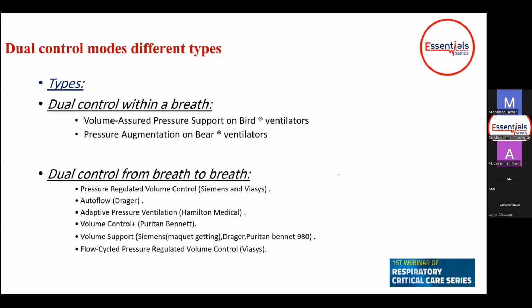You do have sometimes in Bennett ventilator, volume control, VCV, and VCV plus. So VCV plus is a dual control mode, not a volume control mode. A spontaneous mode, which is dual control, common spontaneous mode, is the volume support mode. It's found in Siemens, Dräger, and in Bennett 980.